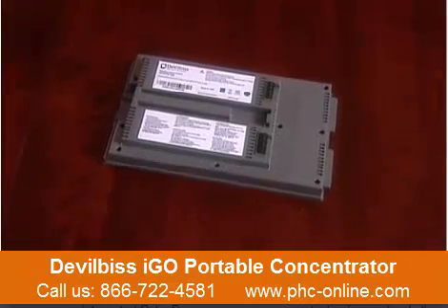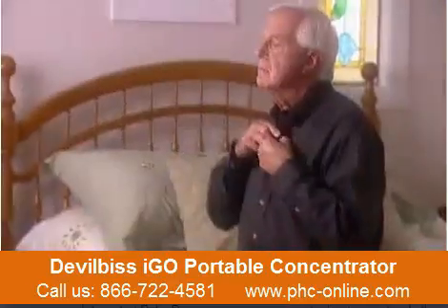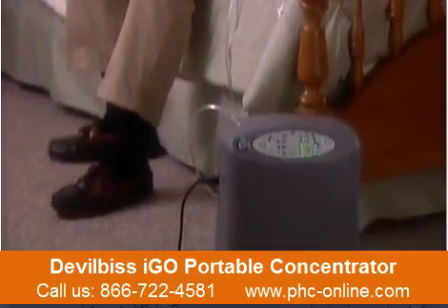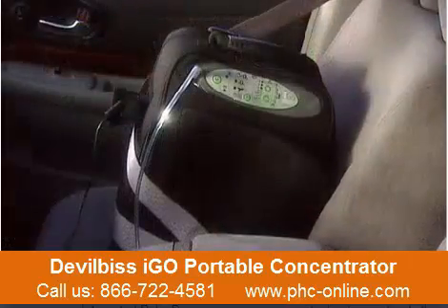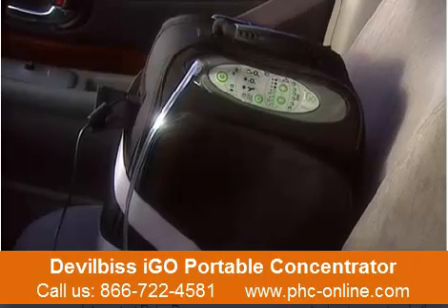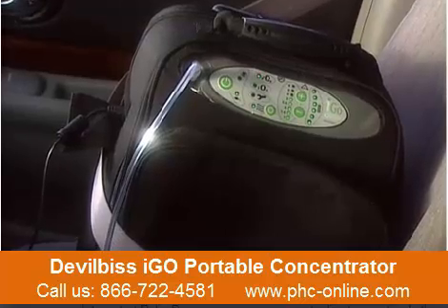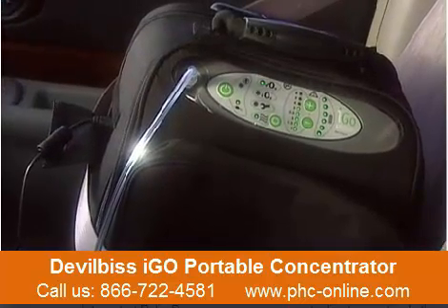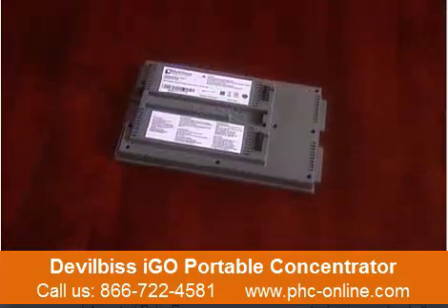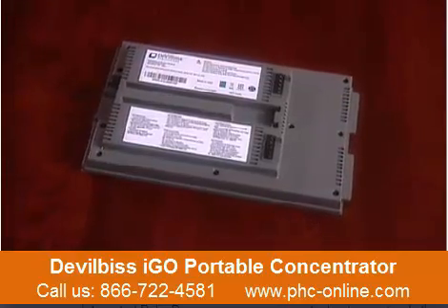For added convenience and security, your iGo system can be operated from a rechargeable battery. Under normal operating conditions, the battery will be continually recharged while operating the unit under AC power. Your iGo system will not recharge the battery while connected to the automobile DC adapter. This is to prevent the iGo from drawing too much power from the vehicle and possibly blowing the auto fuse. The iGo battery will not discharge while connected to the automobile adapter. If external power is disconnected, your iGo system will automatically switch over to battery power.